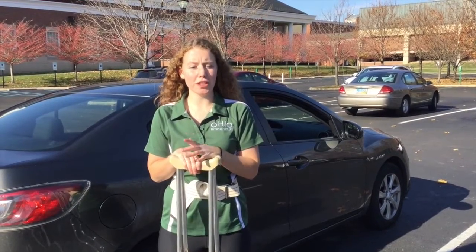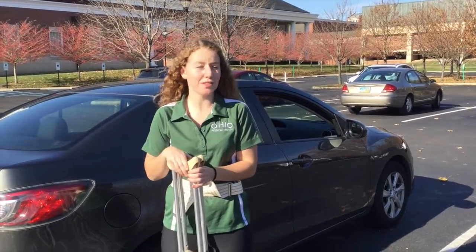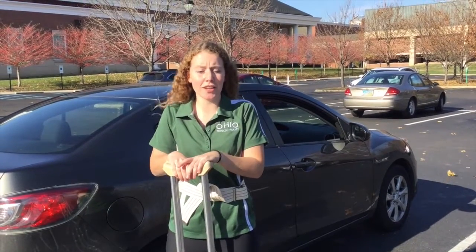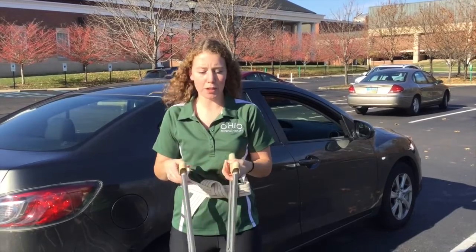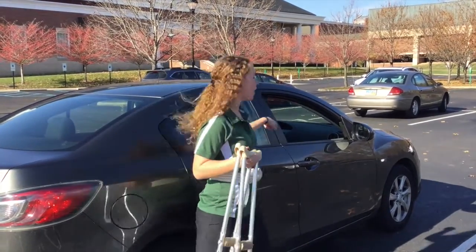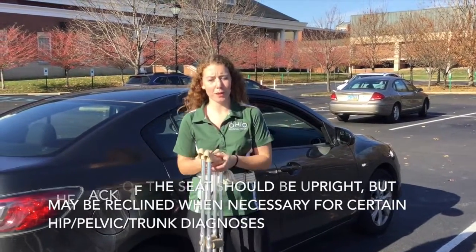So before you do this transfer, you need to make sure the area is prepared and the patient is properly fitted with the appropriate assistive device. And you can refer to skills 29 and 30 for appropriate fitting of an assistive device and for proper gait techniques. And then you also want to make sure that the car seat is pushed as far back as possible to allow for easiest entrance into the car for the patient.